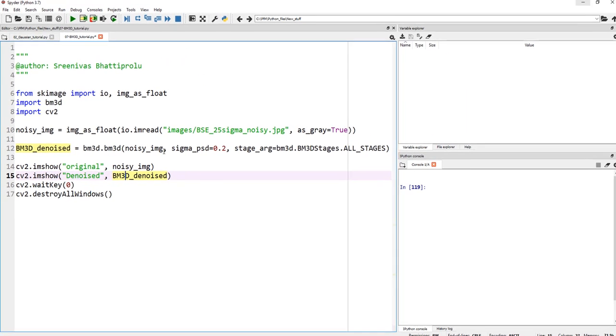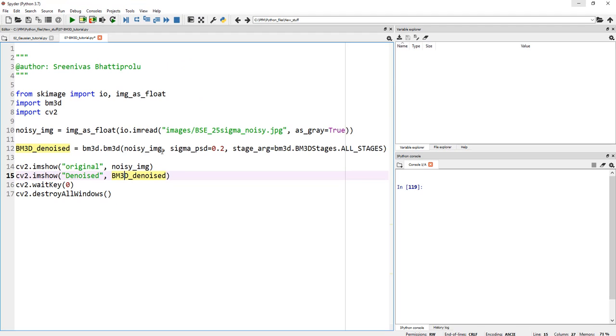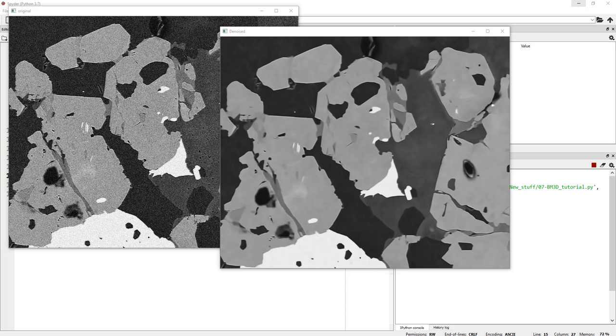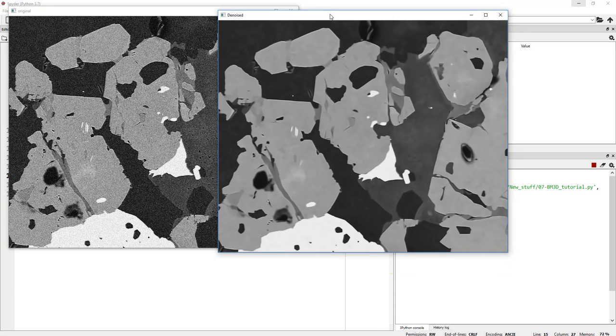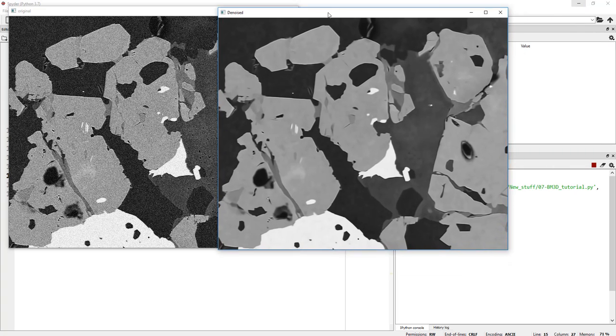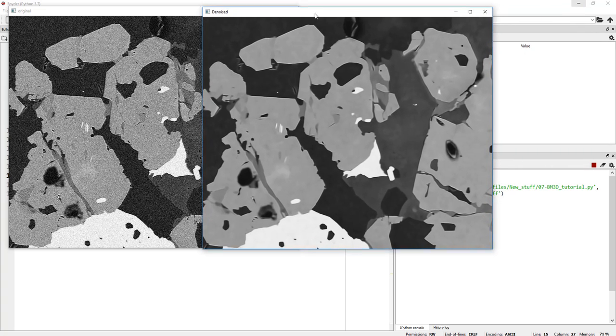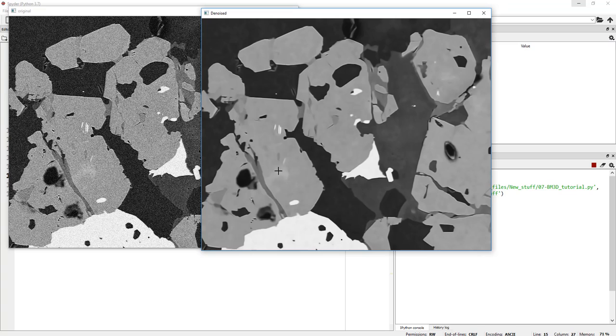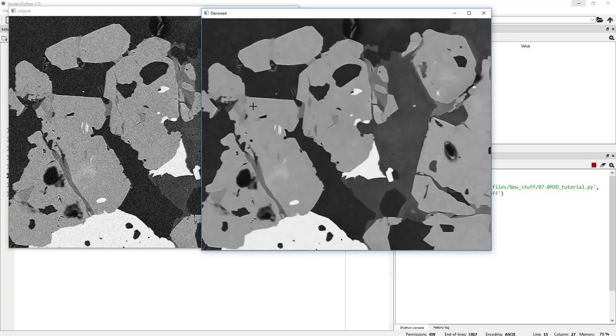This would be a bit slow, so I'll probably pause the video and then continue. Here it is. It took about 40 seconds or so. You can see how the denoising is very, very nice actually. Maybe a bit over-denoised, so you can control the sigma value and see how that affects this. Apparently, this BM3D works amazing on MRI images. I tested this on CT images. It works great, and it is brand new, from 2019.